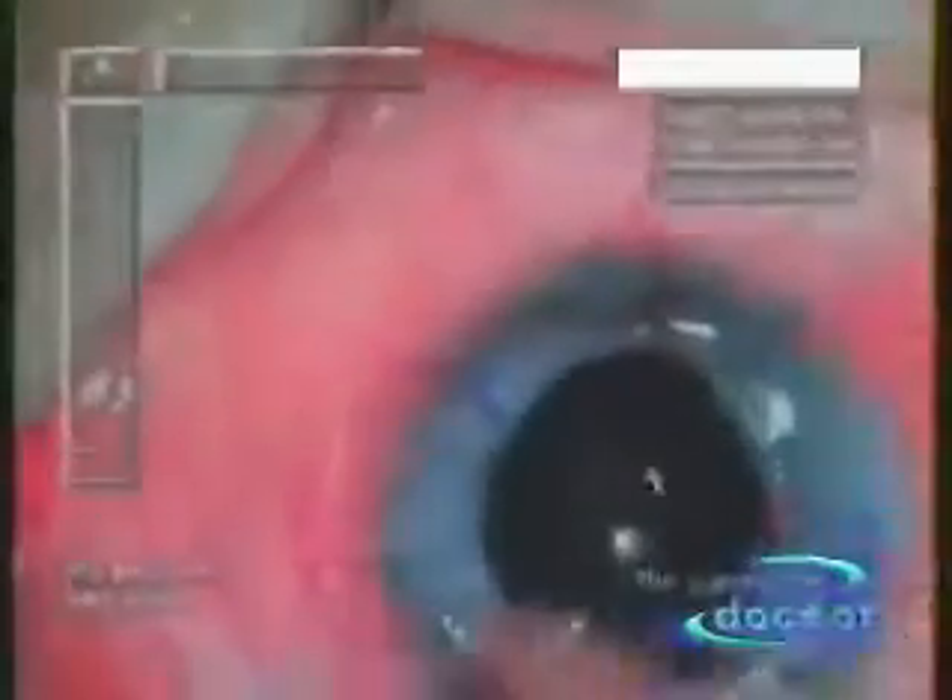The eye is now surgically prepared to receive the new, previously punched out donor cornea. This new transparent cornea is carefully positioned over the pupil or the iris area.